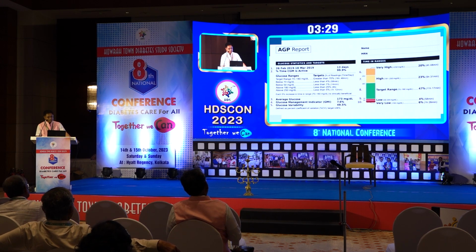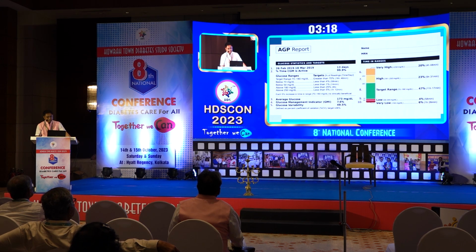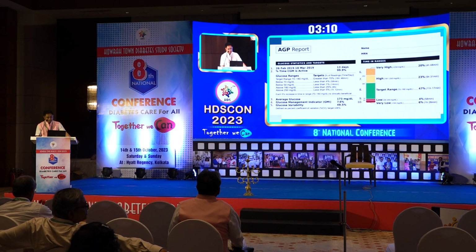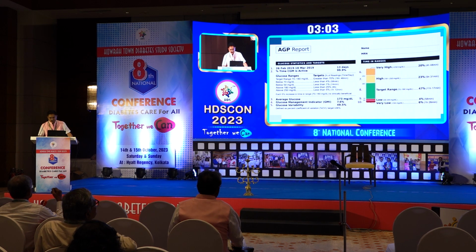Hypoglycemia below 70 is around 4%. Below 54, that is level 2 hypoglycemia, is less than 1%. Hyperglycemia more than 180 is 25%, and more than 250, that is very high hyperglycemia, is less than 5%. They also give the average glucose here, and the glucose variability is 49.5%. So the target of this glucose variability is less than 36%.